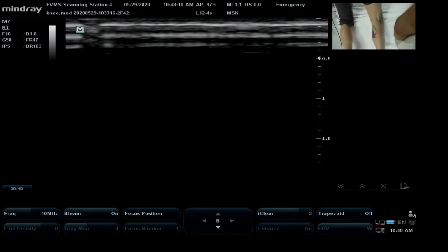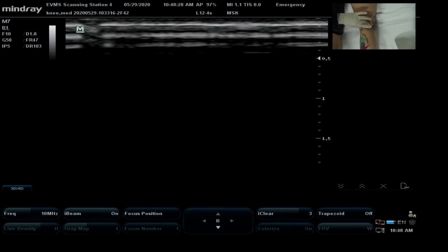Okay, so our patient is going to be in a prone position, and we'll notice that we can look at the popliteal fossa, that triangular area in the back. We would call it a triangular area because of the way that the muscles, if you imagine this skin layer wasn't here, which of course we don't want her to lose, we would see the lateral head of the gastrocnemius, the medial head of the gastrocnemius, and then tendons on either side.